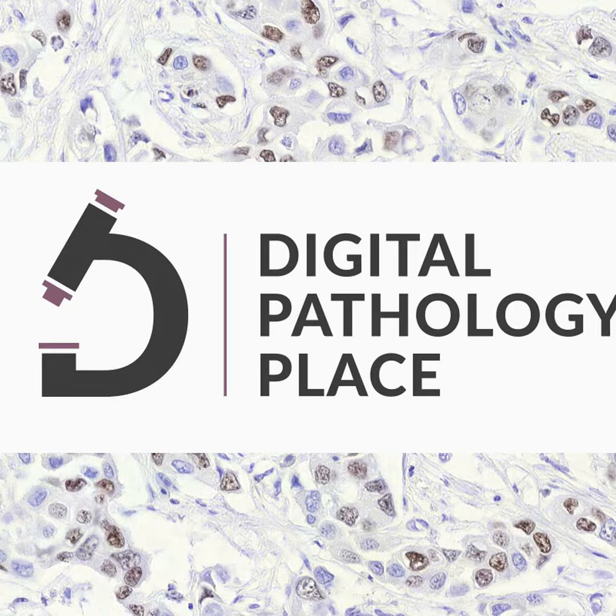So you mentioned nuclear grooves. Yeah, nuclear grooves were the troublemakers. The study is designed with 3 different cases for each feature, and our curator chose 2 cases that are what I would call textbook: thyroid cancer and ovarian cancer. These are things where, if you're a medical student, you're learning about these. It's like, oh, nuclear grooves. If you see those, you think thyroid, you think ovarian. And there are a handful of other things you think of as well, but medical students can't memorize everything, right?